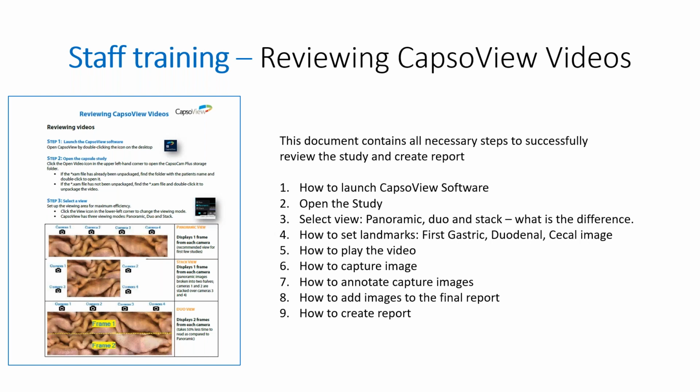Okay, let's move to the next big one, staff training, reviewing the CapsoView videos. So this document, I believe it's five pages long. It has screenshots and steps on how to review the video, how to launch CapsoView, how to open the study, how to annotate images, how to add images to the final report, everything.